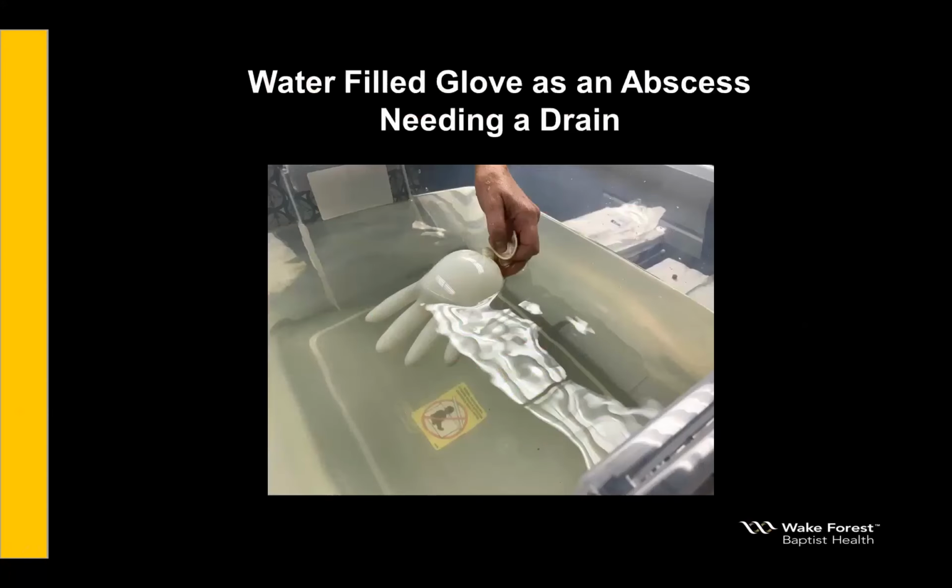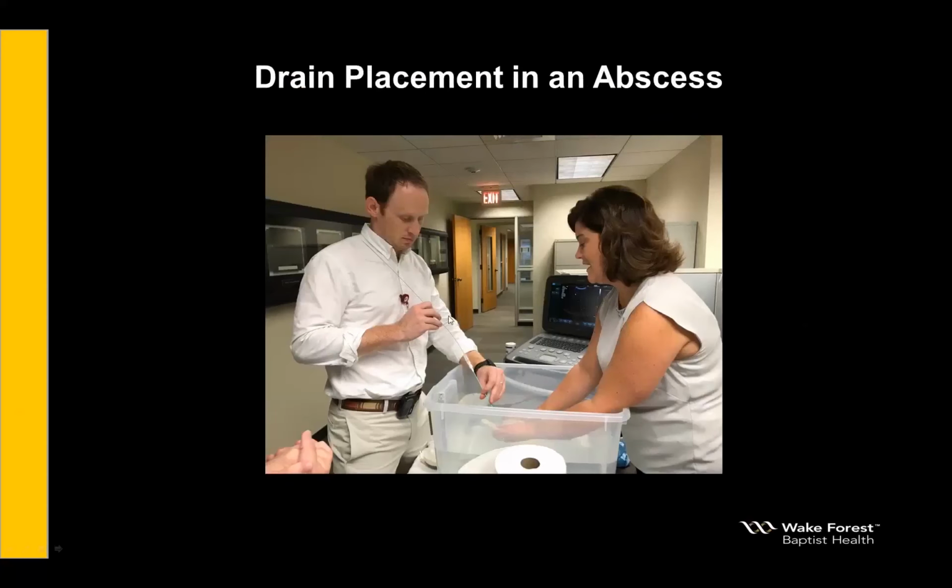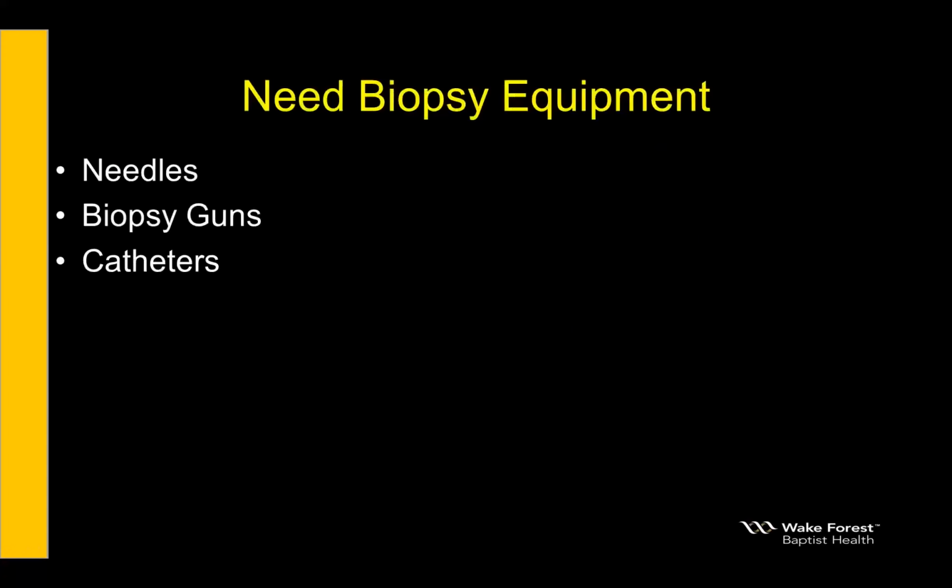ultrasound. This is the water-filled glove as an abscess needing a drain. You can have the residents, with one of our residents, practicing putting a drain in the abscess, and the gloves in your fingers serve as the bowel floating around the abscess.